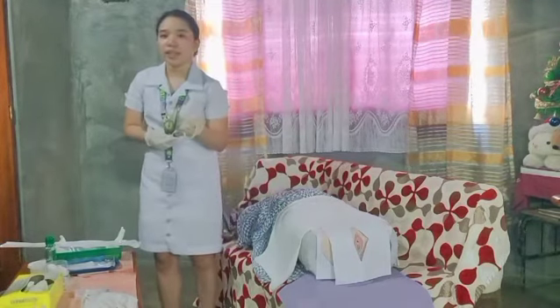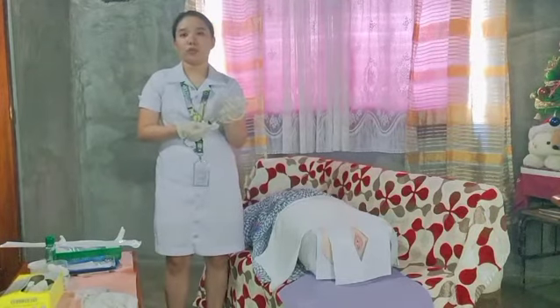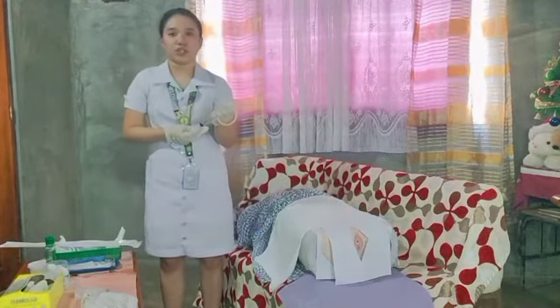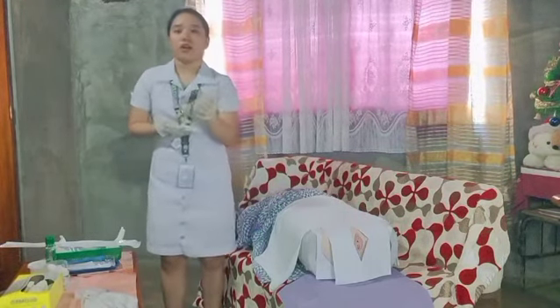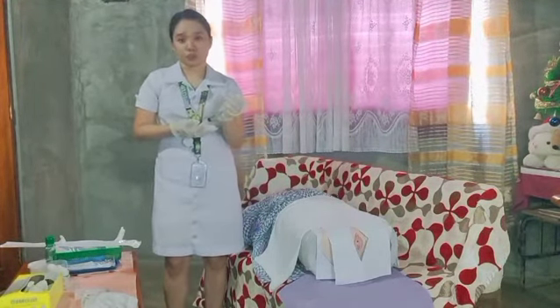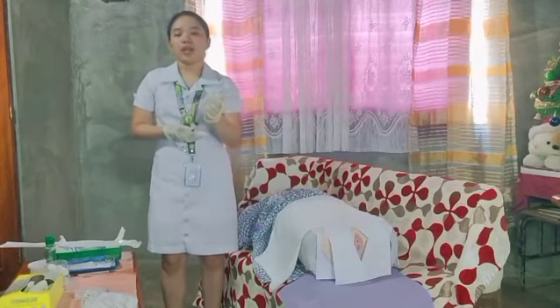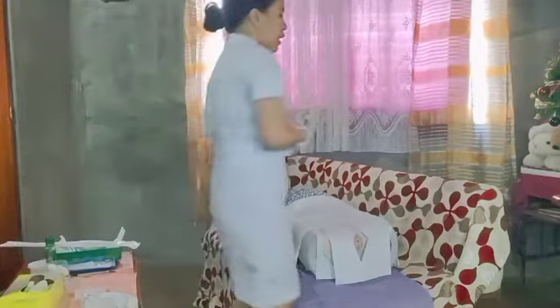So, with the dominant hand, hold the catheter and advance it 7.5 centimeters until the urine flows from the catheter, then advance an additional 5 centimeters. Also take note that if the urine does not appear in a female patient, then you accidentally inserted it into the patient's vagina. Okay? Ma'am, ready na po tayo.